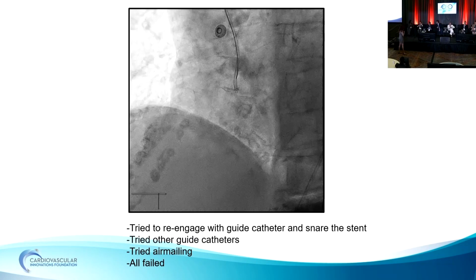Any other? Just one question. Generally, how do you guys prep the stents? Do you prep them at all? When I was trained, we used to prep them. Now, reps have told me that we shouldn't be prepping them at all. Exactly. And that's what we do. We don't prep them anymore. We're told not to prep.